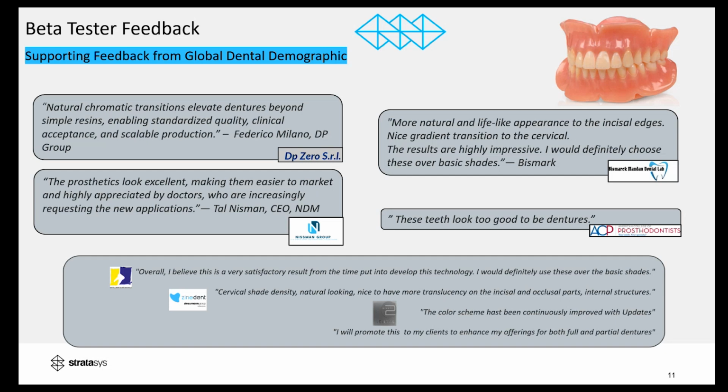Yes, you can expect a slight increase for the TrueDent Clear because we're introducing a clear edge, but it's going to be a minimal effect, and I'm not sure most of you would notice it. No difference in print time because it's the same exact engine processing all those models.